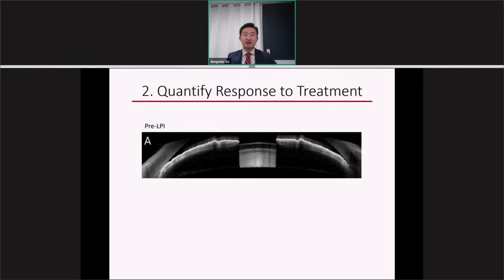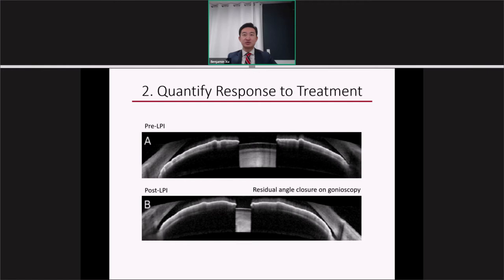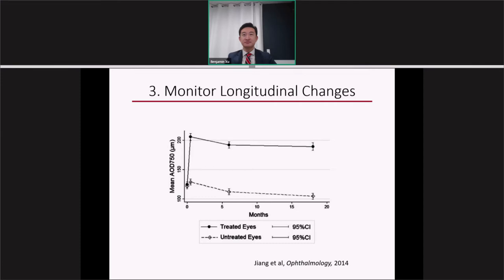Another application of ASOCT is the ability to quantify response to treatment. Using the Heidelberg Spectralis with the anterior segment module, we can visualize the iris, lens, and anterior chamber angle. In a patient who received a laser peripheral iridotomy for angle closure, there was still residual angle closure on gonioscopy after treatment. However, based on ASOCT, we can see widening of the angle and use measurement tools to assess exactly how much the angle has widened after treatment.